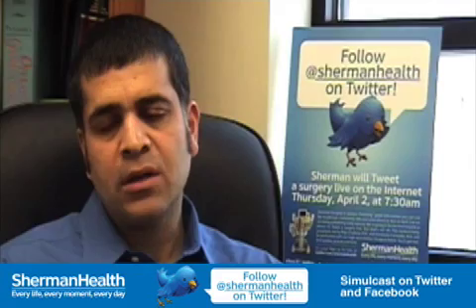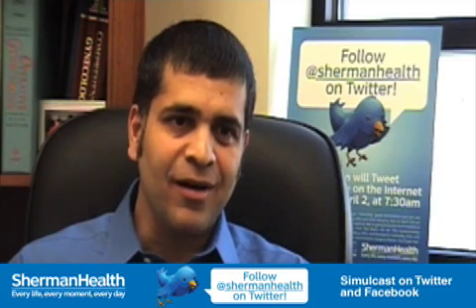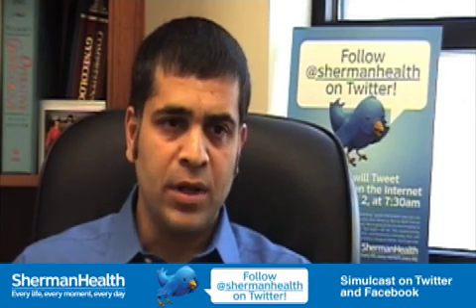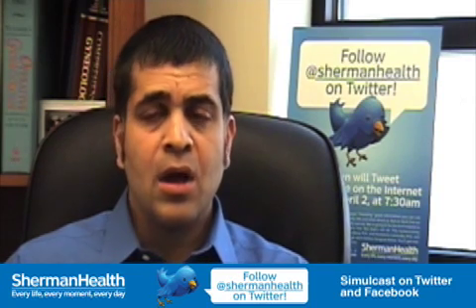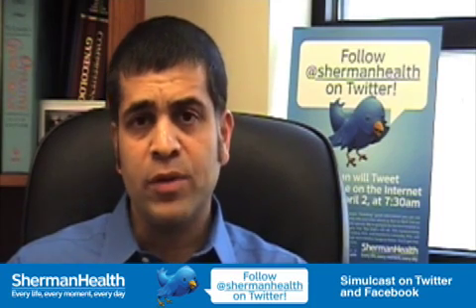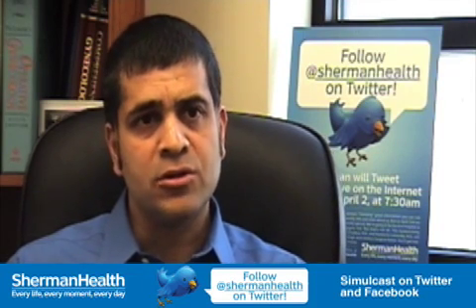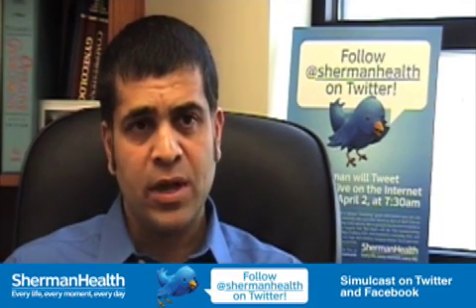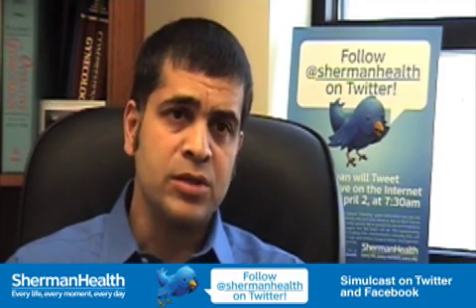That's a good question. In surgery we were always trained to have 2 sets of hands around the patient just in case it was needed, and having operated for many years, I know that it's always good to have an assistant surgeon around. With the robot itself, in case we would have to open the patient for whatever reason, for some complication or things like that, the assistant surgeon is at the bedside, right next to the patient and scrubbed in. It takes us less than a minute to get the robot out of the way and to open up the patient and then stop the bleeding or whatever complication there is to fix.